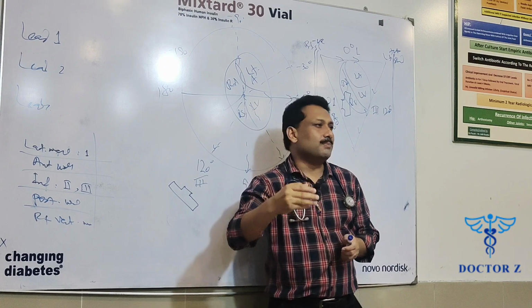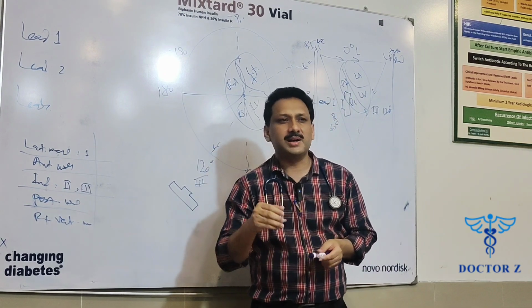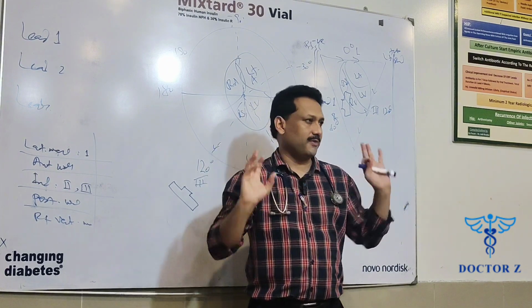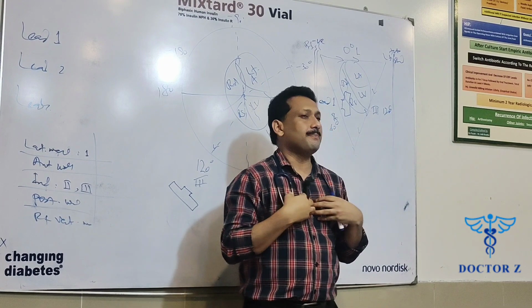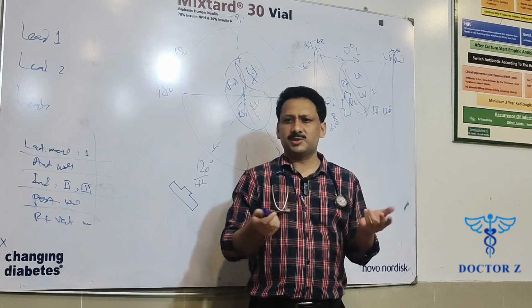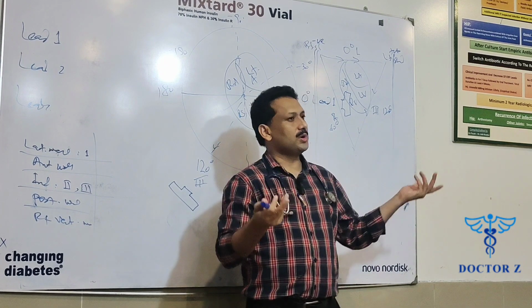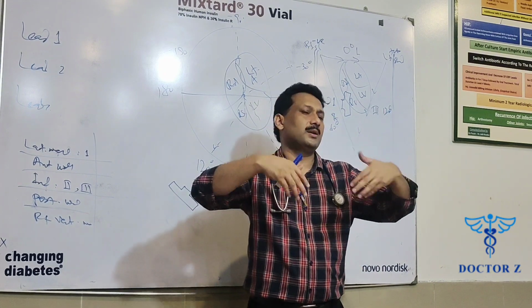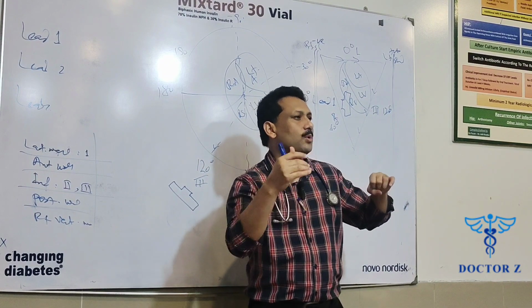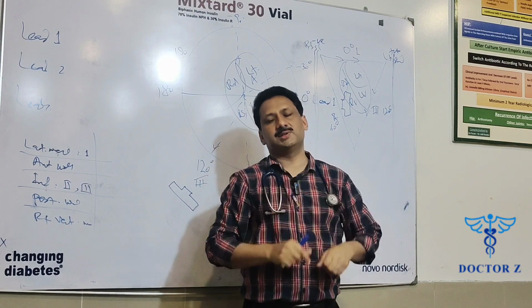Now to make things clearer and better, what did the scientists do next? They said that now we have taken information related to these 3 chambers. We want to seek more detailed information. So what are we supposed to do? Just place more cameras. You want to see the heart? Place more cameras. You want to see it in a much better way? You just need to place more cameras. Add more and more and more, and you will be seeing it from all the directions.